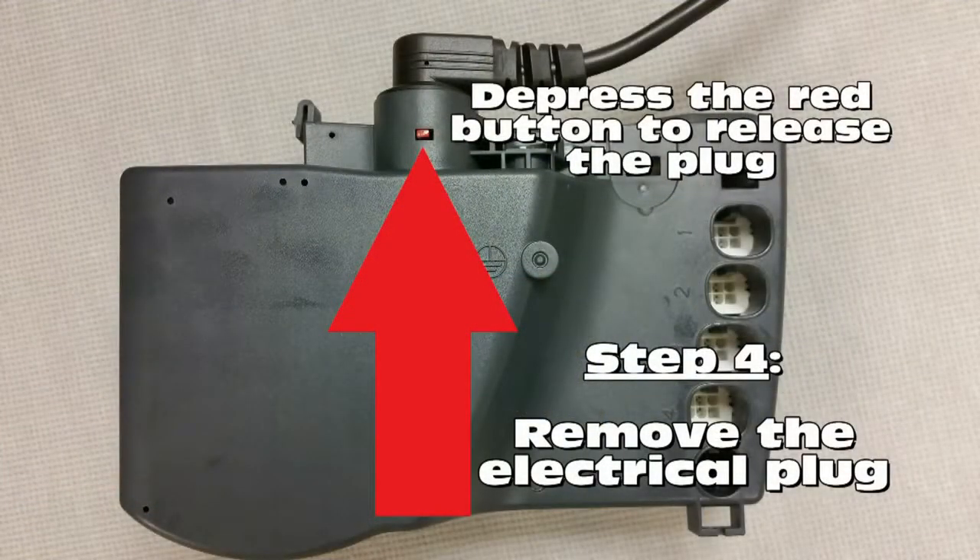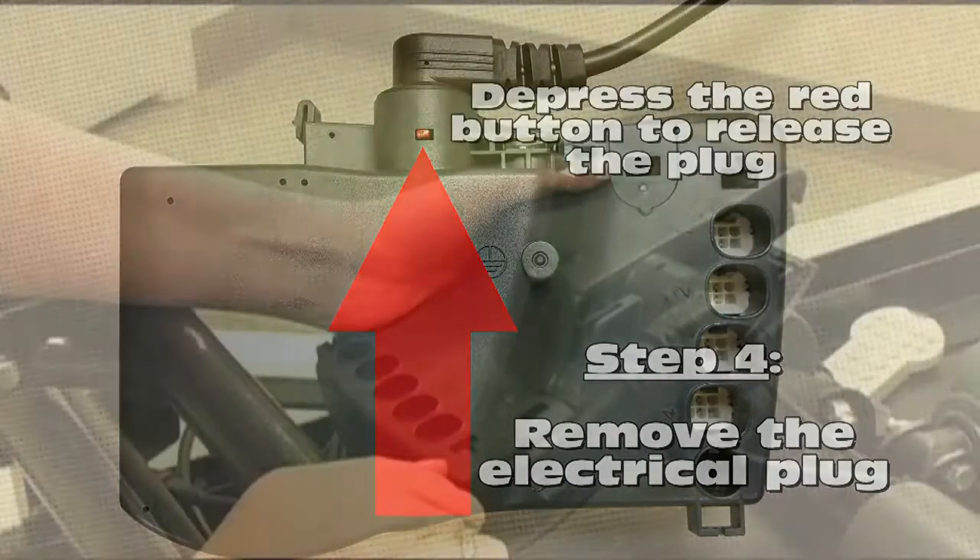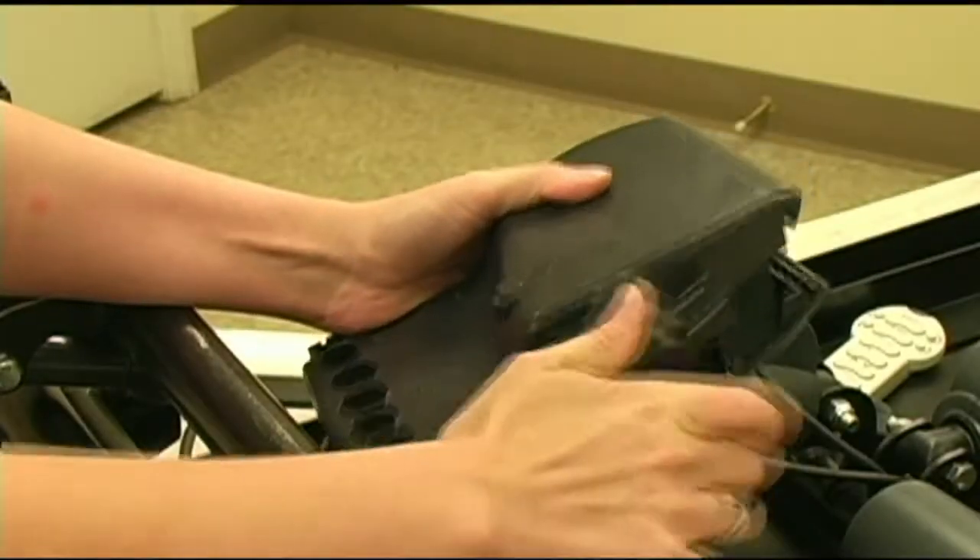The final step in removing your control box is to remove the power cord. The power cord can be removed by depressing the small red button seen here with a flathead screwdriver. Once the red button has been depressed, you should be able to remove the power cord.